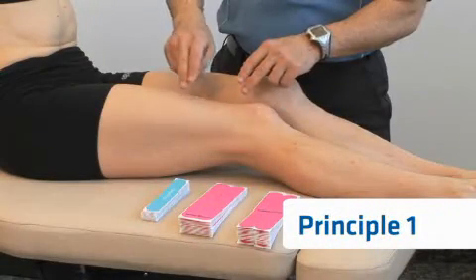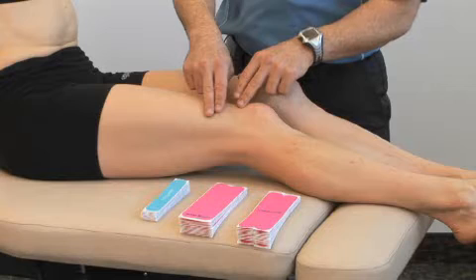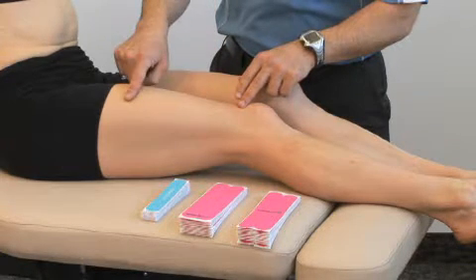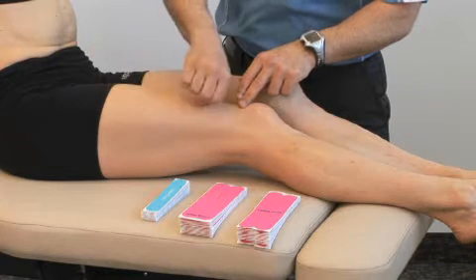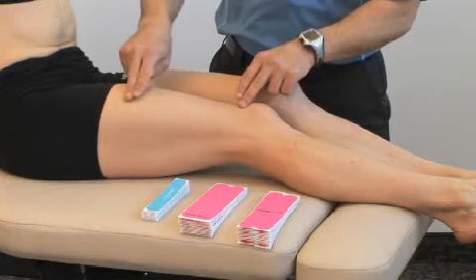For principle number one, the application of the tape goes directly on top of the skin. The skin should be clear of any excessive creams or oils and any hair. Clipping may be required with a set of clippers. You don't necessarily need to shave, but just clipping any excessive hair will do.